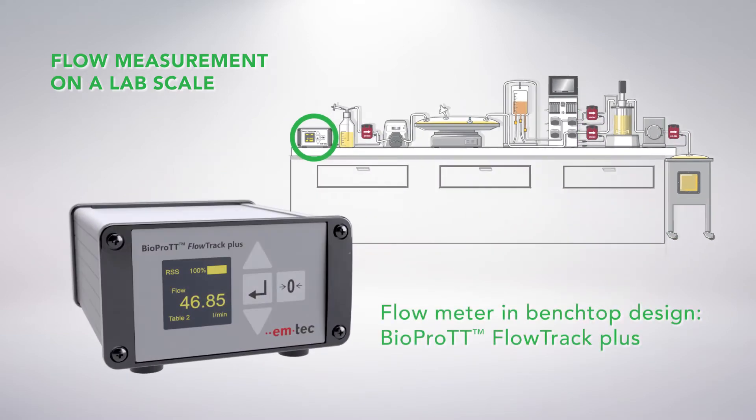The BioPro TT Flow Track Plus provides real-time monitoring of the volumetric flow rate. It features an integrated display and a compact, space-saving benchtop design ideal for use in laboratory environments. No additional hardware or software is needed.